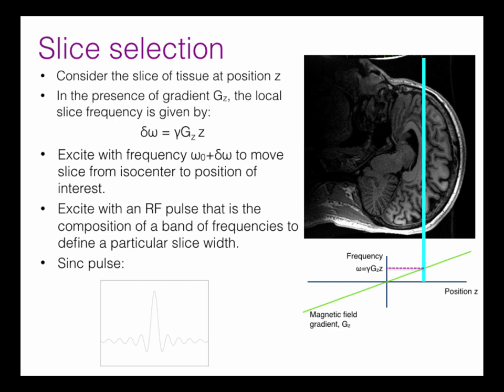And the reason they're unaffected is basically because they're spinning at a different frequency. And remember that B1 needs to go around with the magnetization. So if it's at the wrong frequency, initially it's at a certain position with respect to magnetization, and then after a very short time it becomes out of phase with it. And so the effect of that field cancels itself. So it really only affects the magnetization inside that band, and it has very little effect anywhere else. And so we just excite into a transverse plane the spins in this slice plane.